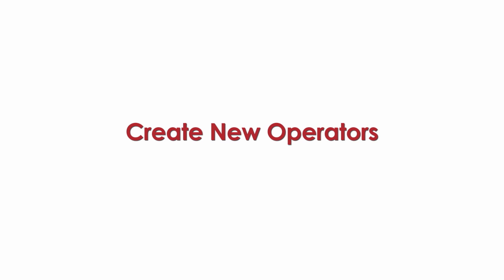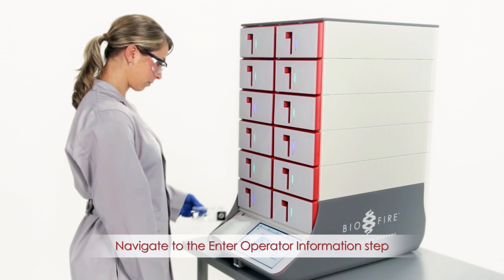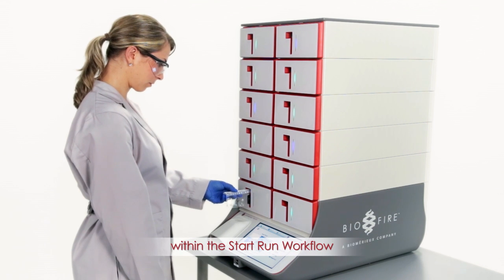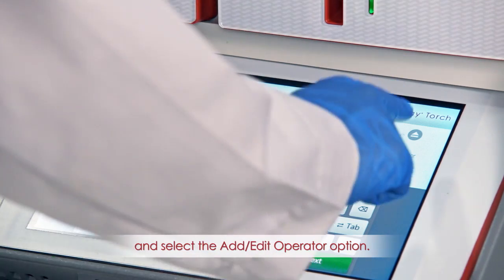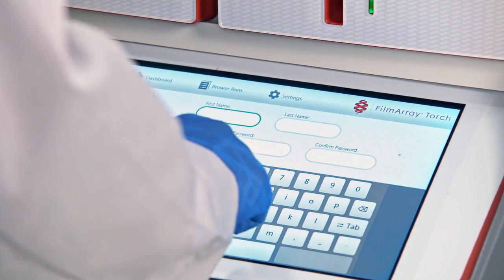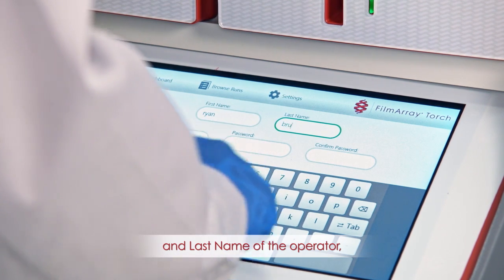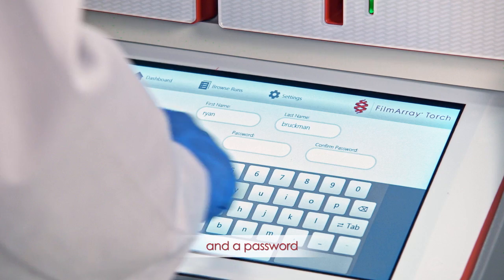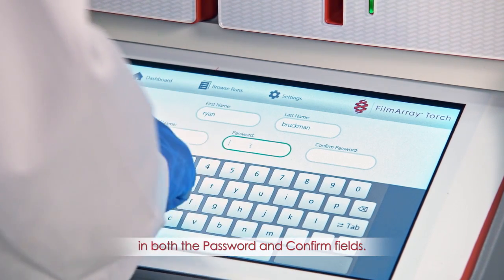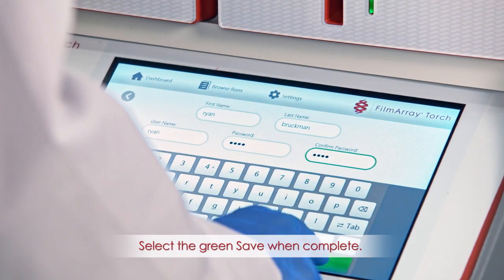Create new operators. There are two ways to create a new operator. Navigate to the Enter Operator Information step within the Start Run workflow and select the Add Edit Operator option. Enter the first name and last name of the operator, a username, and a password in both the Password and Confirm fields. Select the green Save when complete.